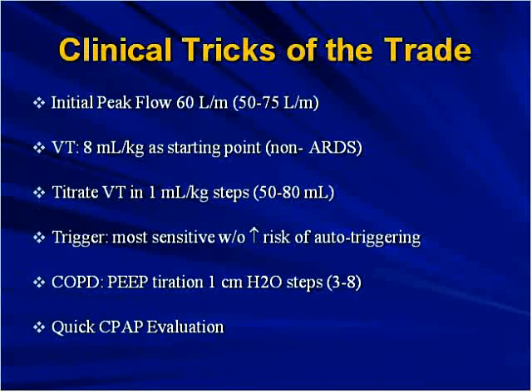And then there's another trick of the trade, which we've instituted at San Francisco General this past year, but something we've been using unofficially for decades, which is a quick CPAP evaluation. I'm going to talk about that in just 1 second.